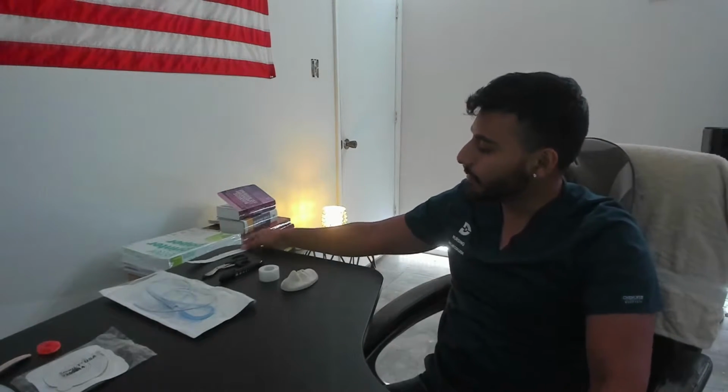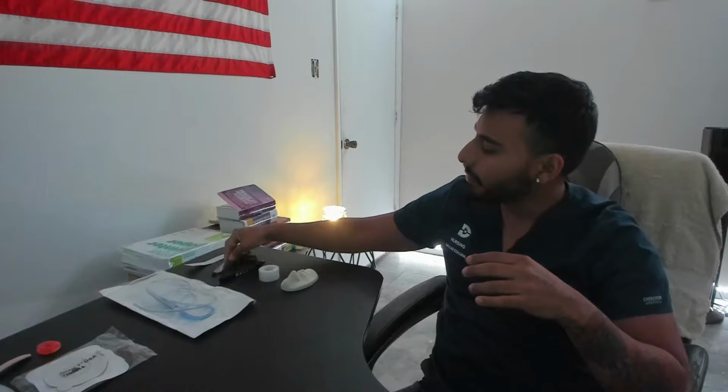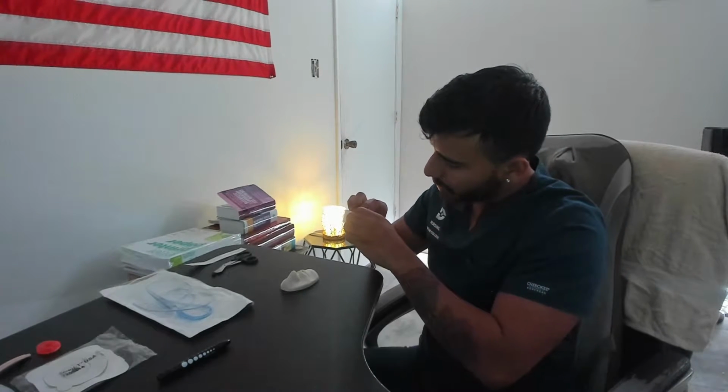Once I have his stuff set up, now I'm going to get my side set up. I'm going to prepare my bedside, which has my ruler to measure my tape. I'm going to have my scissors to cut my tape, my tape, and a lubricant with me. I'm going to have my NG tube. Okay, so once I have my bedside set up, I want to prepare my tape. I'm going to have 3 different pieces of tape. One tape is going to be attached to the nose to sling the NG tube to the nose.